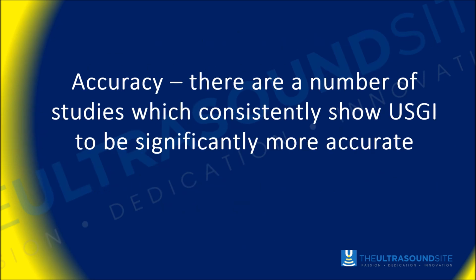So first of all, accuracy. There are a significant body of studies that consistently show that ultrasound guided injections are more accurate than surface marked injections.